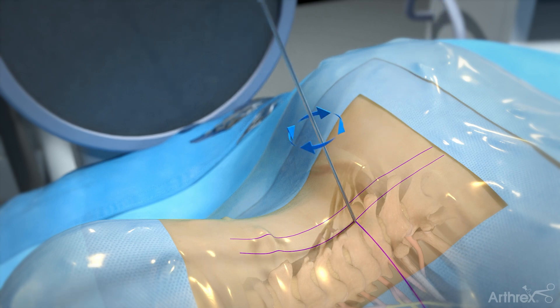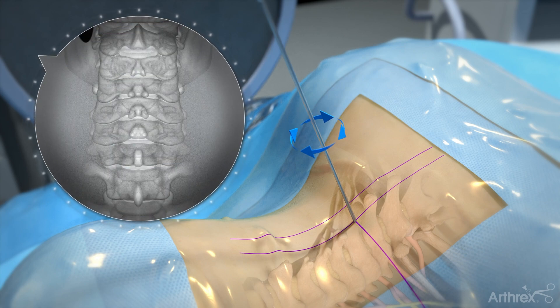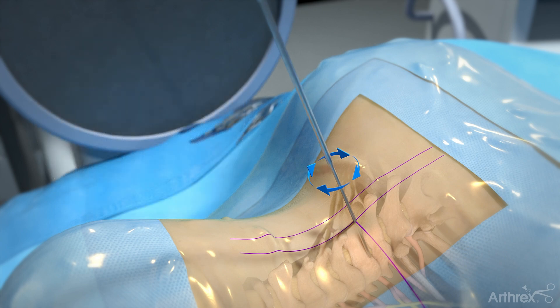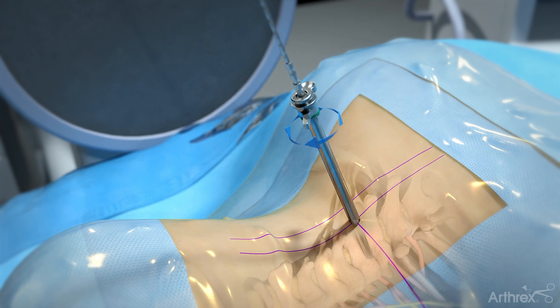Using an AP view, insert the first dilator towards the facet joint, confirming once bone contact has been made. Next, confirm the position of the dilator using a lateral view. Dilate up to the diameter of the cannula using a rotation motion with each dilator. Place the working cannula while rotating and advance to bony contact, confirming with lateral fluoroscopy.